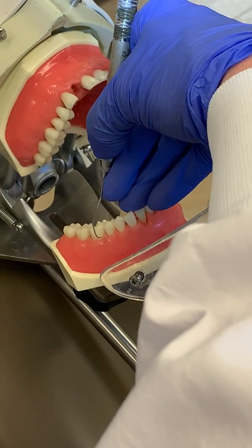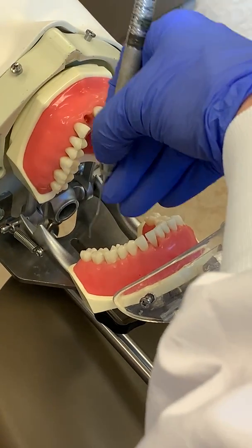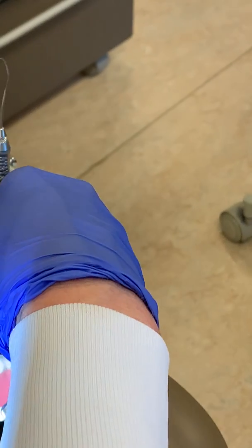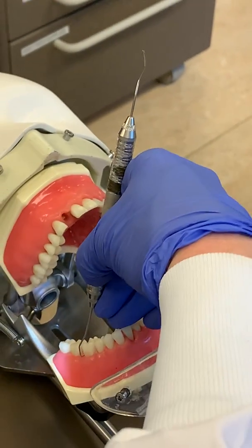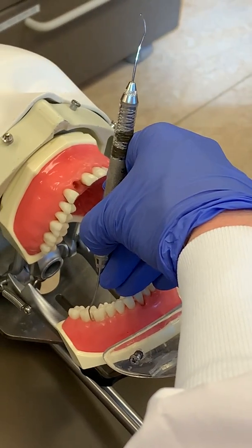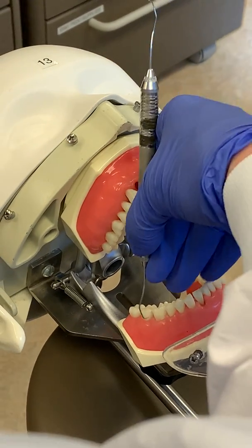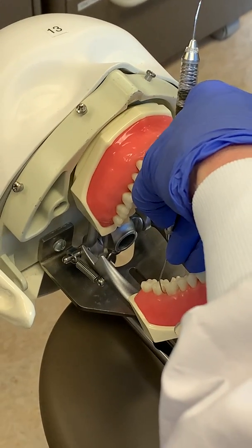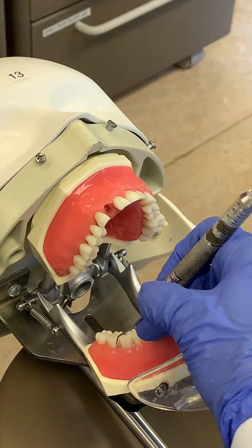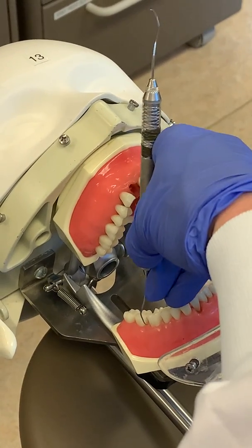When you explore, start on the distal. Begin at the distal facial line angle and explore into the interproximal area. The tip always points toward the direction you're moving. Get up on your fulcrum so the terminal shank is fairly parallel to the distal surface you're exploring. You wouldn't want to fall over and have the terminal shank not parallel to the surface.